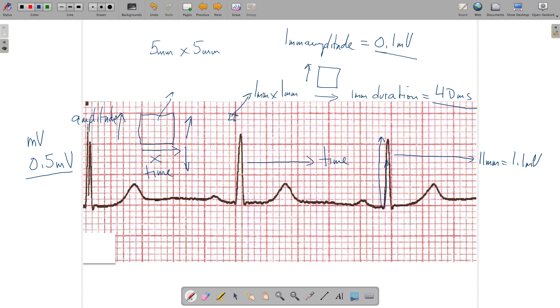To summarize the graph paper: the big dark pink grid lines represent a 5 by 5 millimeter square. They also represent a deflection of 0.5 millivolts and a 200 millisecond time duration — so every big box represents 200 milliseconds. Each small box represents a 0.1 millivolt deflection and a 40 millisecond time duration. These are critically important because everything in EKG interpretation is about how long something lasts or how tall or deep the deflection is.